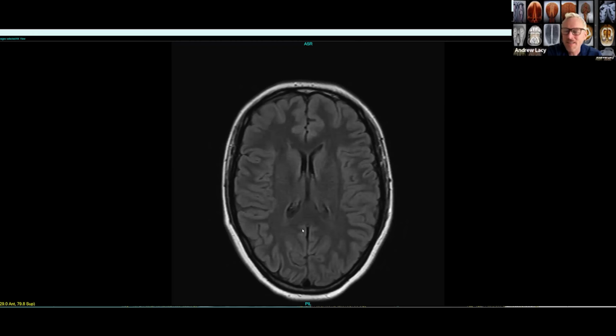The question of false positive is a little hard one to answer because these tests are not the last test you would get before a cancer diagnosis. It's more about risk stratifying what we're seeing. Yeah, I do think that's a fair summary and nicely summarized. I think it's important to understand the context that we're doing this in: we are screening the entire body essentially, and we are looking for findings. Our bodies produce cysts and other types of abnormalities, but it doesn't necessarily mean they're actionable. Using this type of risk stratification system, something called OncoRads, and one that's been internally developed called clinically significant diagnosis, CSD, we can lump these findings into certain categories to help convey what we're trying to say about them and guide management.